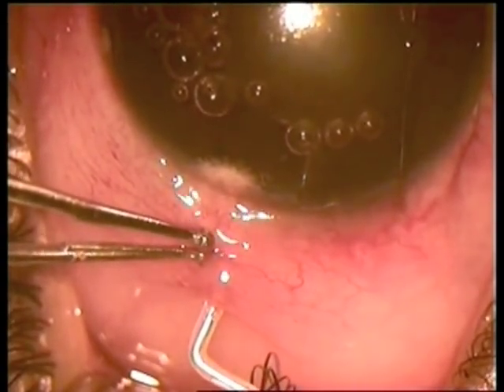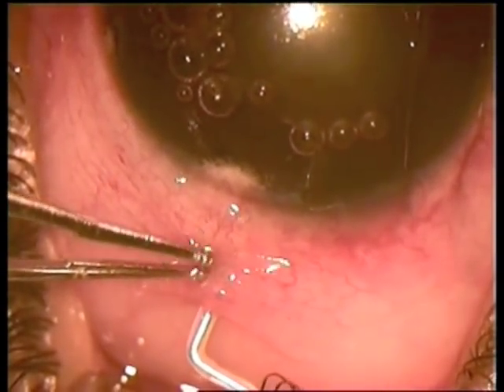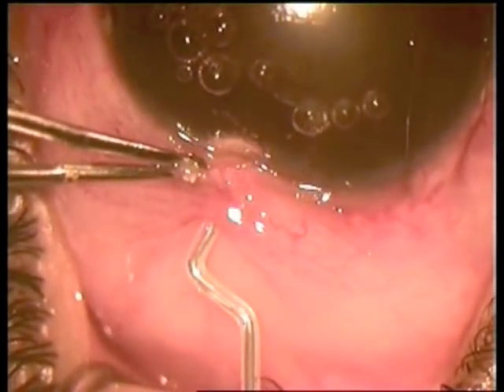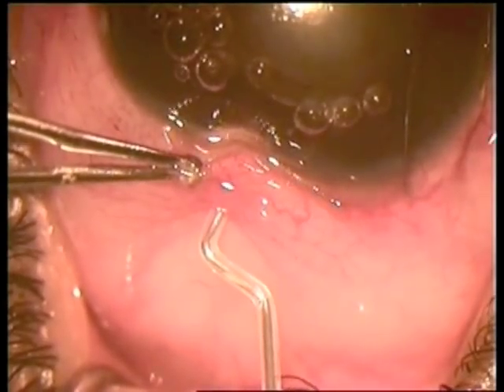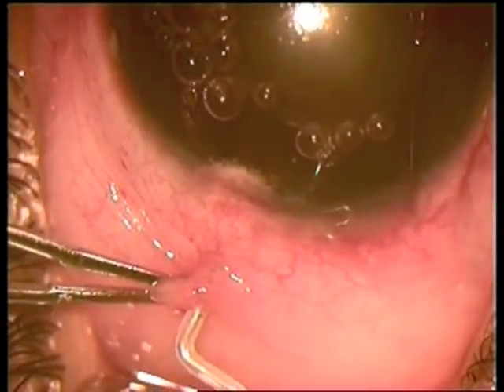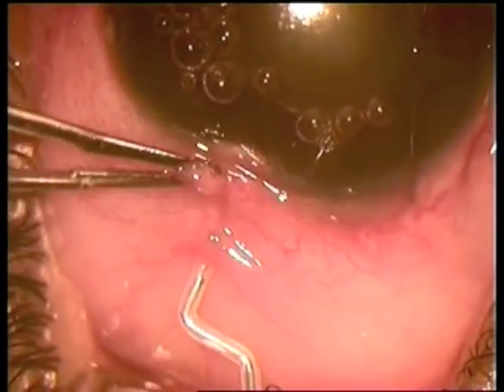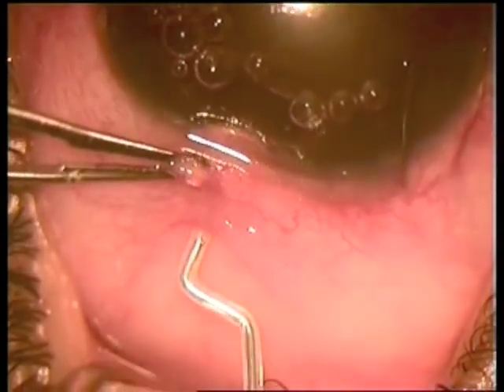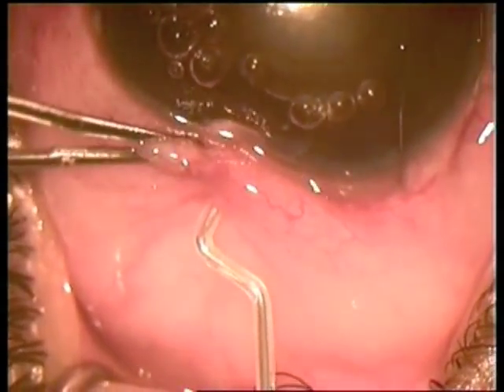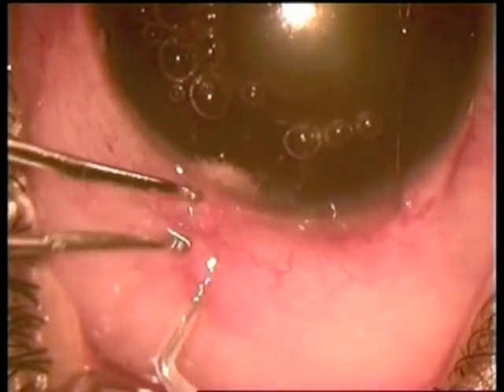One more time — the tip has to be positioned properly at the limbus. It was not activated initially, so we go back to the limbus, activate it, and it gets into the anterior chamber.